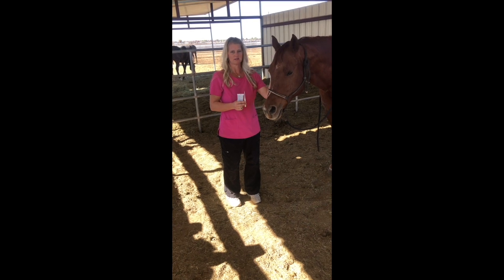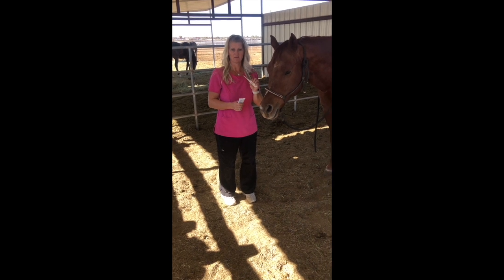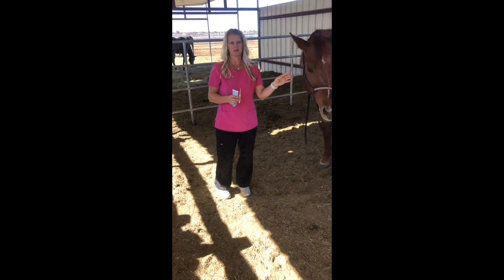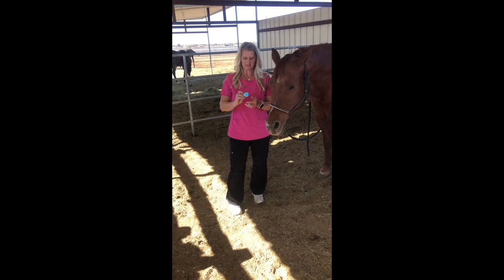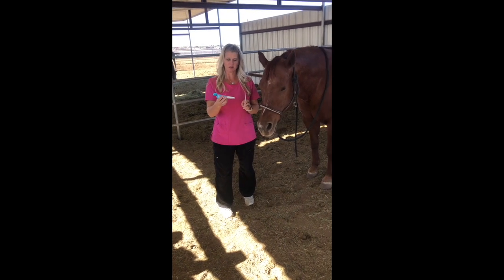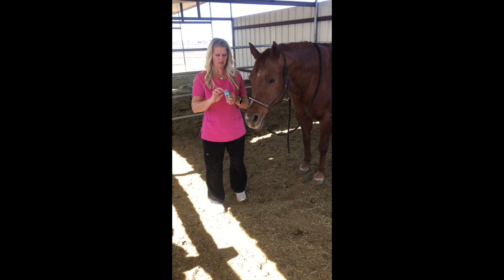So we all know horses are prone to injury, so we don't want to cause any further damage. And these are safe and they're actually faster. And if you use the glass thermometers and they break, the mercury is actually very toxic. So we don't want that going into the horse's system. Okay, so the first thing you're going to do is you're going to get your lubricating jelly, which is just regular petroleum jelly, again at any store. And you just put some right here on the end.